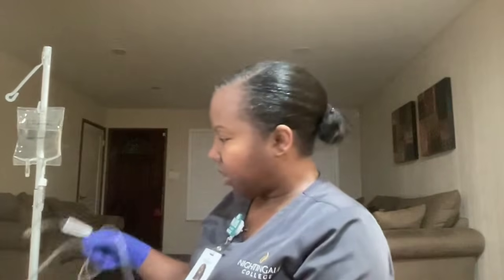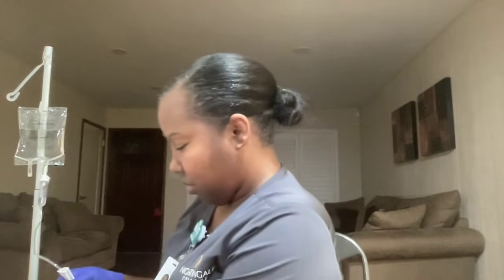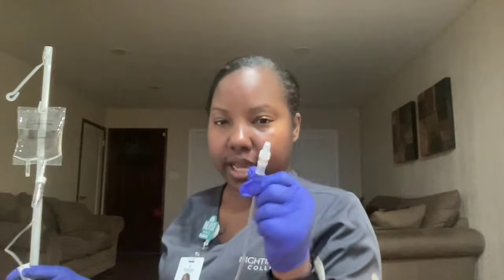Okay. So you will prime the line to get any air bubbles out of the line. And then you'll be connecting this adapter to the patient's peripheral IV site.